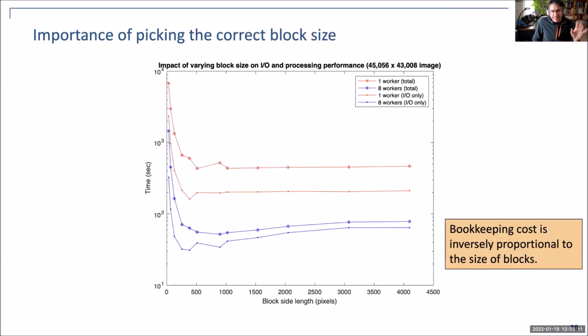And this is an example that shows what happens if you pick the wrong size of blocks. So notice there are 2 orders of magnitude difference in performance between the 32 by 32 blocks over there on the left-hand side and the native 512 by 512 block size. And most of that's because of repeated file IO calls. Even though we do some caching in the background in ours, it's just the extra bookkeeping and reloading that has to happen in order to get those blocks.